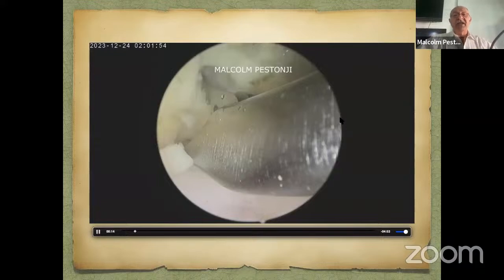That punctate hemorrhaging tells me that the flavum is now thin. Also, you are able to almost see through the flavum. You can realize that the flavum has become very thin, and now the punctate hemorrhaging has started. So I know that in this stenotic foramen, this stenotic canal, I've done a nice flavotomy.